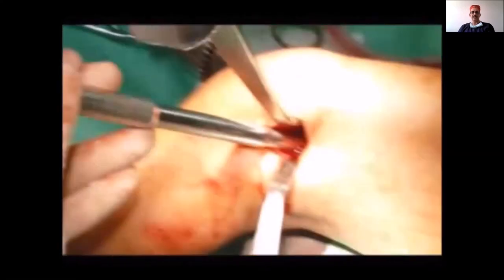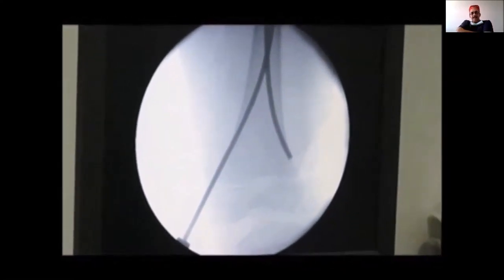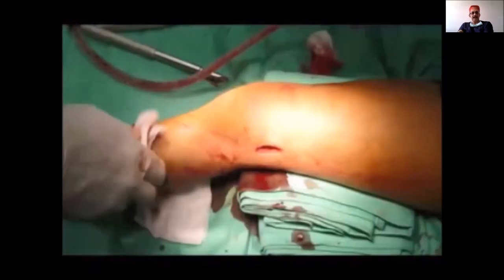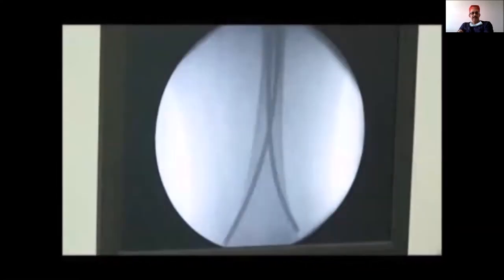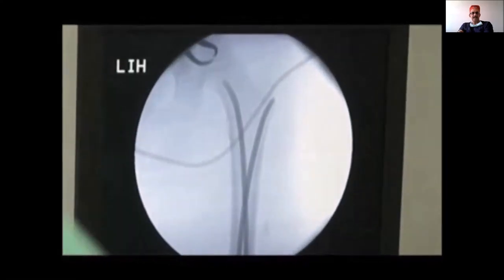When seated flush, you will still have one centimeter of nail lying outside the cortex for later removal. You can see it has moved proximally with the canal well occupied — 80% canal fill with excellent spindling, seating in the neck, and at the trochanter. Once you have cut both nails, check that they are away from the growth plate so you don't cause any growth disturbance or stimulation. Confirm the spindle at the apex and check the seating.